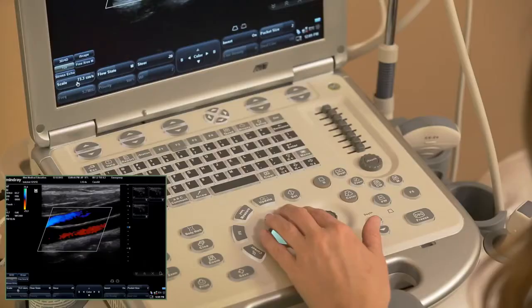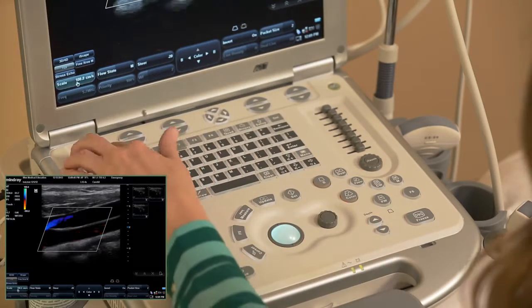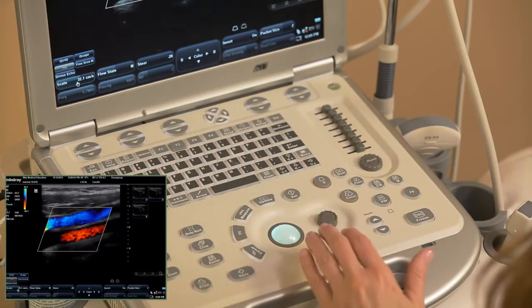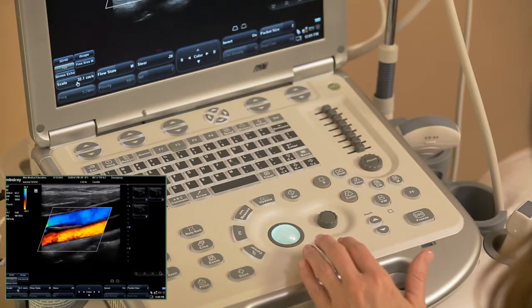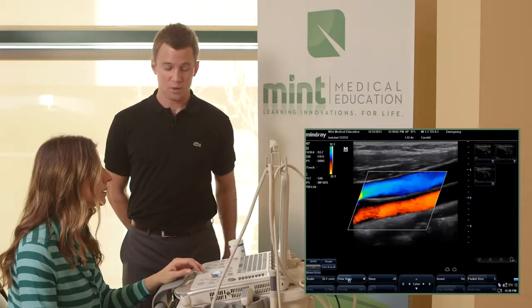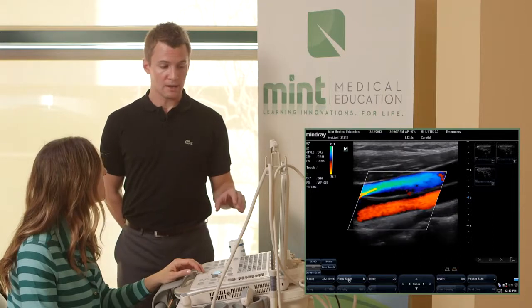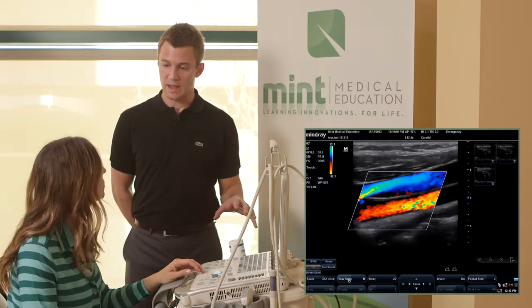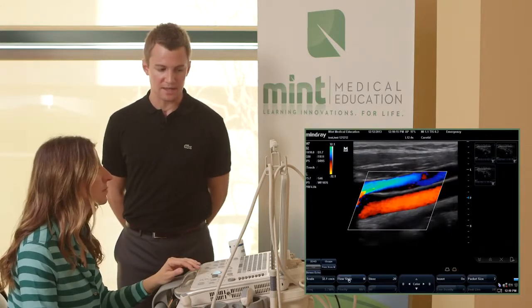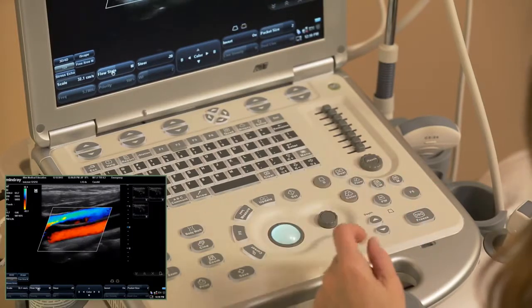Right. Yep. And as a user just getting the system out, or watching this educational video, you won't have to mess with the presets too much. The factory defaults are very good for the settings. It's great to play with, because then you just are more familiar with the machine. And what's good to know is that you can modify any of these things that we talk about, and they won't stay that way unless there's a couple of steps that we can do to lock those, more of a customized default. Okay. And that's something that your clinical application specialist will discuss with you when they get there. Yep, you got it.